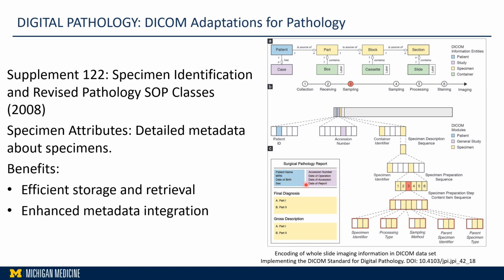All these tags and attributes are stored within the image, and it's not going to be sent by, for example, an XML or spreadsheet. No, it's one single image. And imagine if you can share this image with anyone else, and you can apply machine learning and build tremendous applications or models with this metadata.